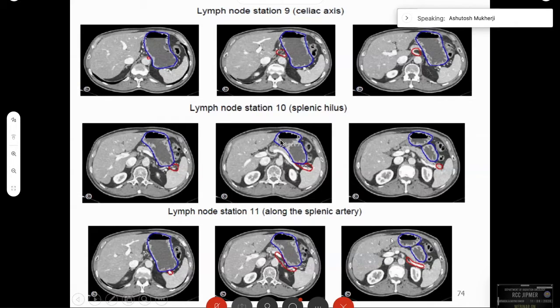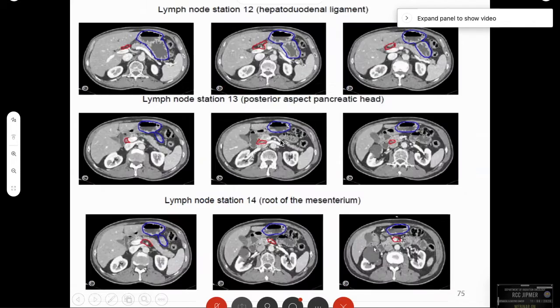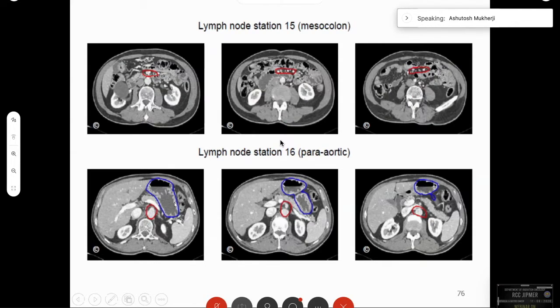Along the hepatoduodenal and posterior aspect pancreatic, you have the posterior pancreatoduodenal nodes and nodes along the root of the mesentery — also named the superior mesenteric artery nodes. Then the mesocolon nodes and finally the paraaortic nodes. In our setup we can do a PET-based nodal chain radiation.